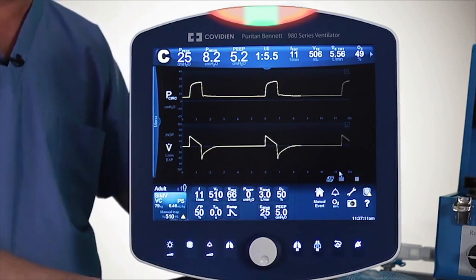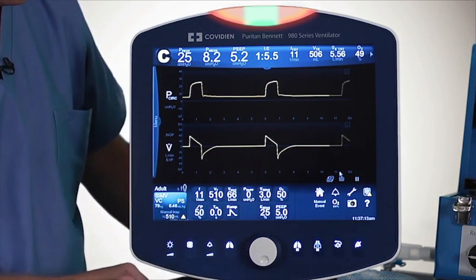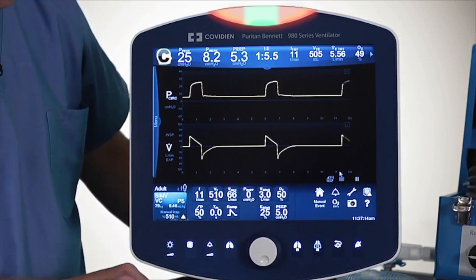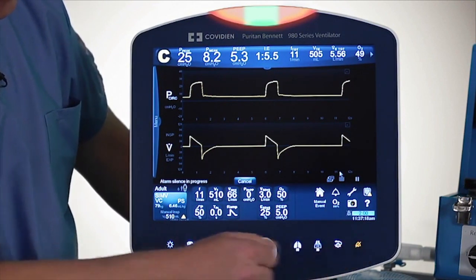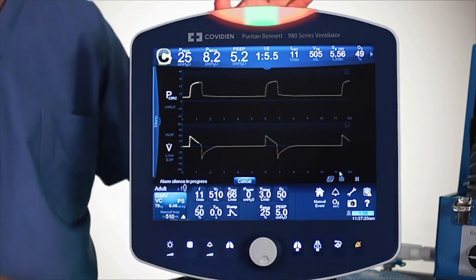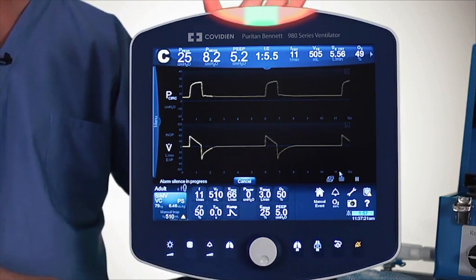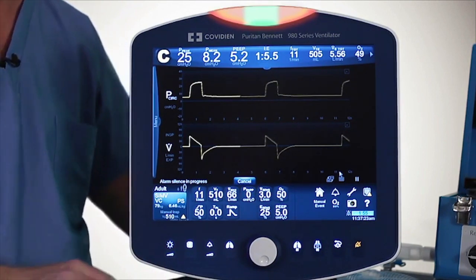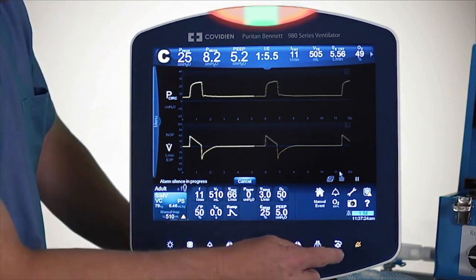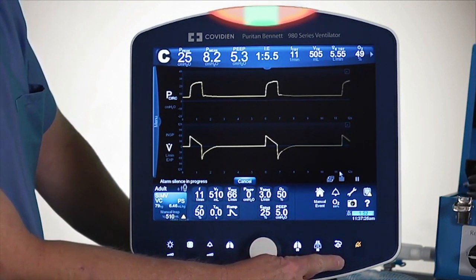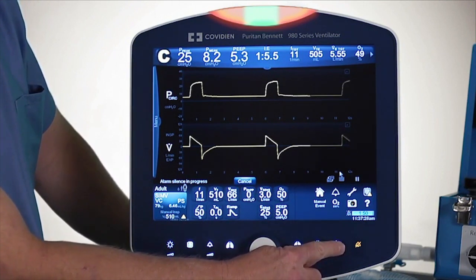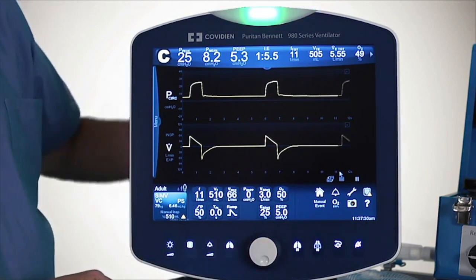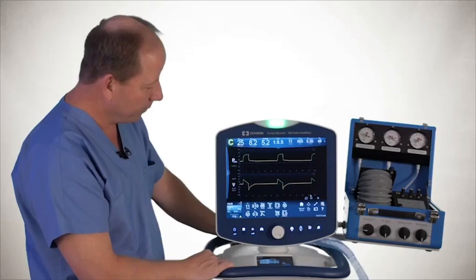The alarms can be silenced by pushing this little button over here — that's the alarm silence. To clear the visual, there is a reset button for the alarms right next to it, and pushing that will reset the visual indicator.